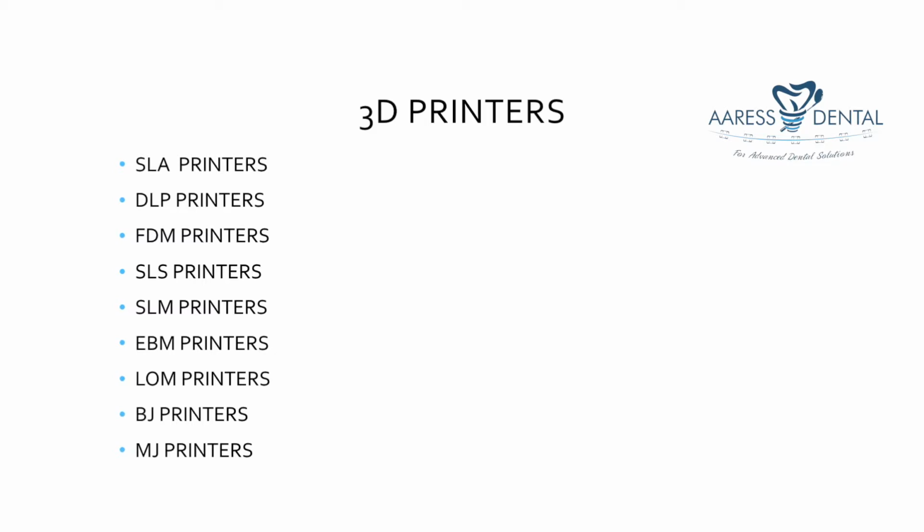There are a lot of types of 3D printers that are available. The SLA printers, DLP printers, FDM, SLS, a lot of types are there. But the most commonly used in dentistry right now is SLA and the DLP printers.